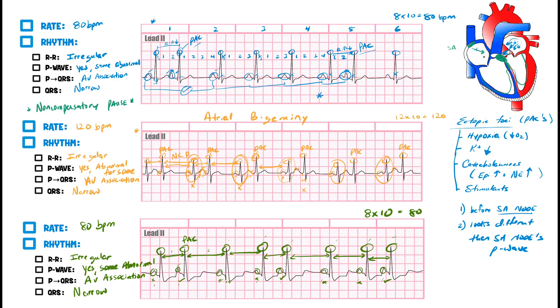Looking at the pattern: here's a PAC — it comes early and its P wave looks different. Then normal R-to-R intervals for two beats — counting them out, they're about the same. Then another PAC, coming early with a goofy-looking P wave. Then two more normal beats, then another PAC. The PACs are occurring every two normal PQRST complexes. This is called atrial trigeminy.